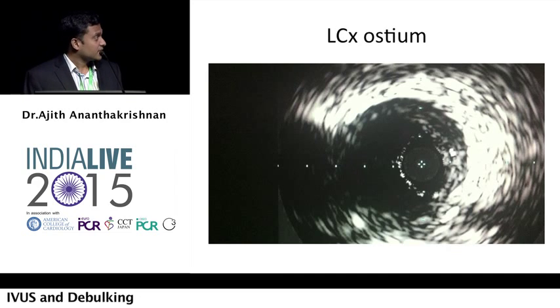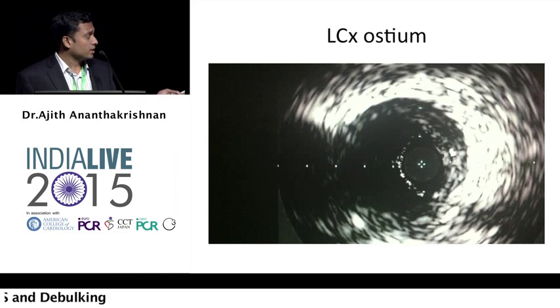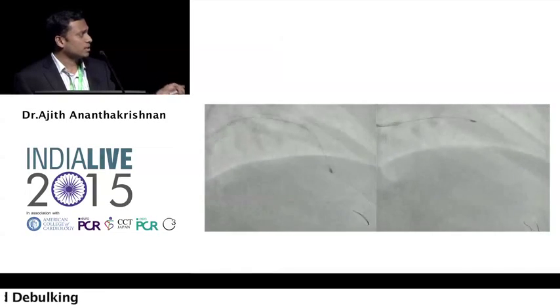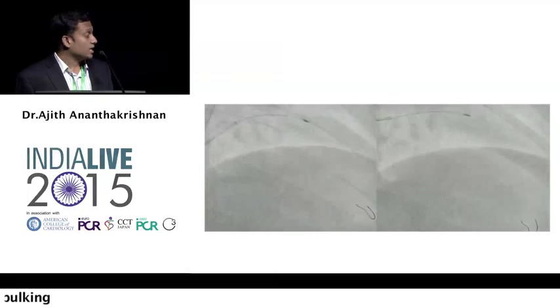Can you go to the next? Yeah. So this is a 1.5 mm burr. The one on the left, we are actually debulking the ISR tissue. The burr is going down to the deep LAD to take care of the distal LAD disease as well.